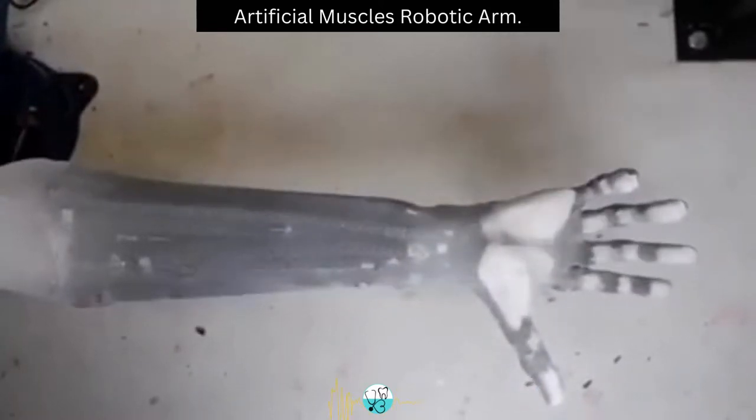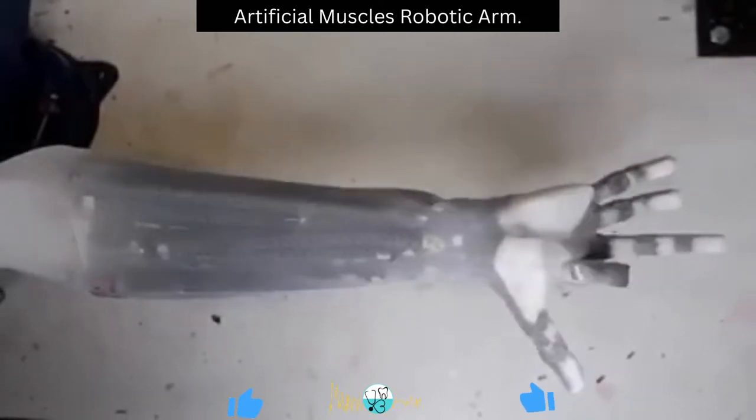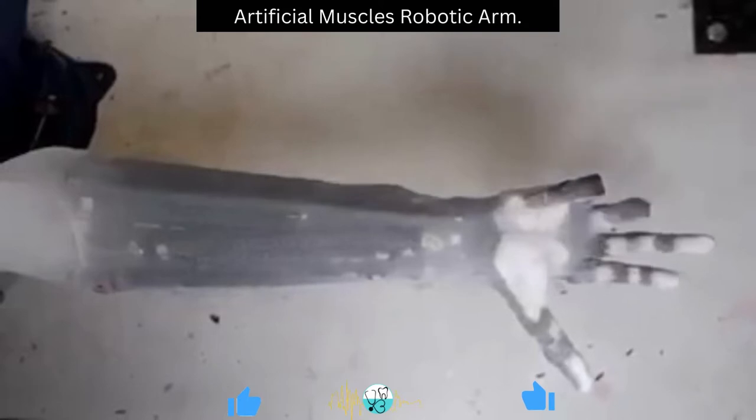Earlier replacements were just for aesthetic purposes and were rather functionless, but recently functional prostheses have been in development which can somehow replicate hand functions and movements.